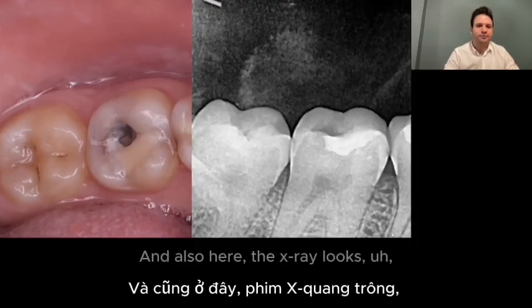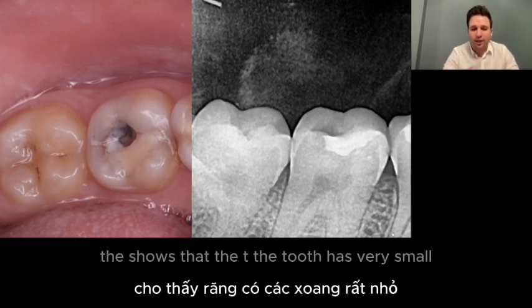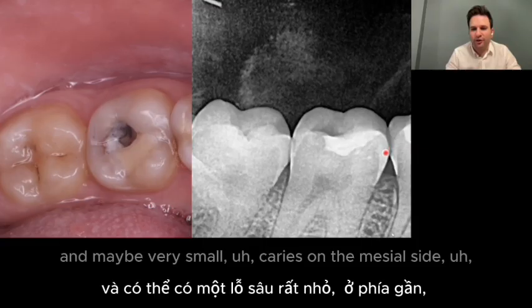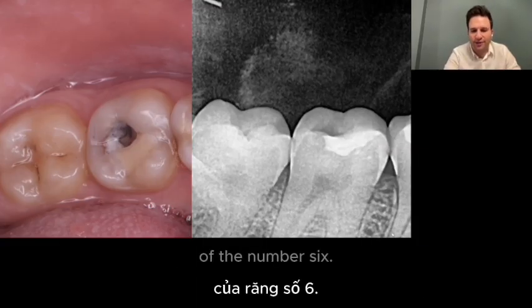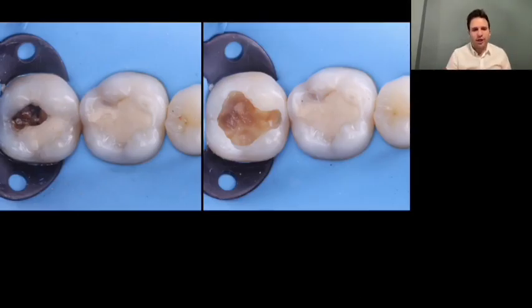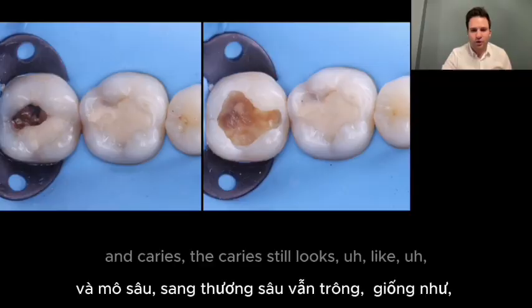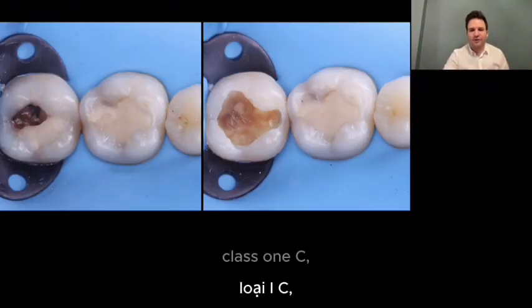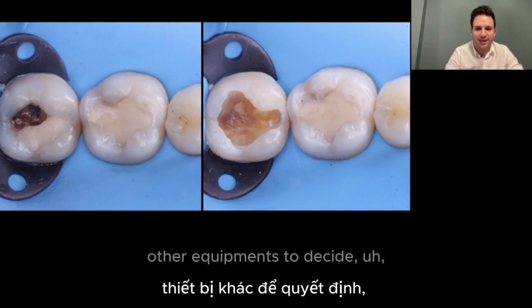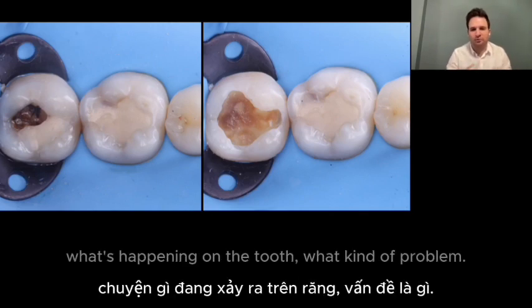And here the X-ray shows that the tooth has very small cavities and a fractured old restoration, and maybe very small caries on the mesial side of number 6. After cleaning the old restoration and caries, the cavity still looks like a class 1 cavity, but this time we can use some other equipment to decide what kind of problem is on the tooth.